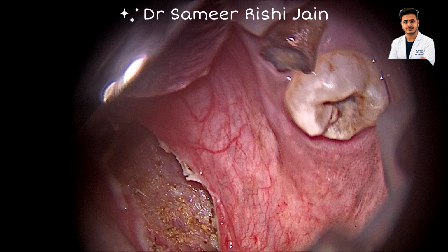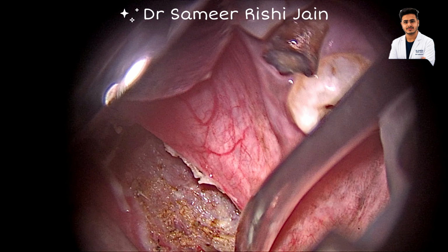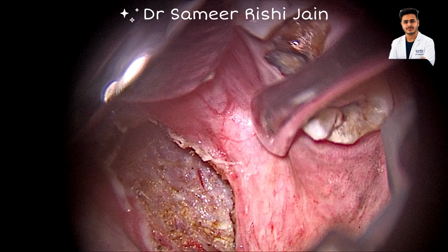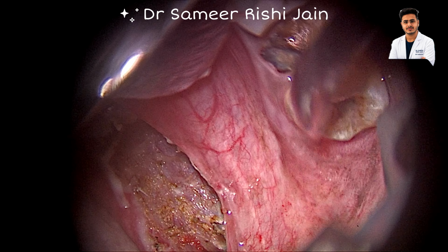After cleaning the tonsillar bed with a gauze, you can see there is absolutely no bleeding from the bed, and the fascia is also preserved. We can say this is a relatively bloodless and painless surgery.